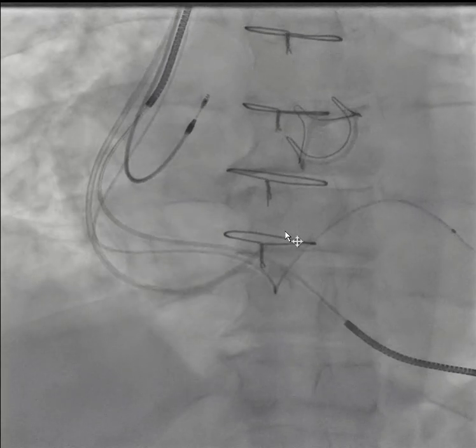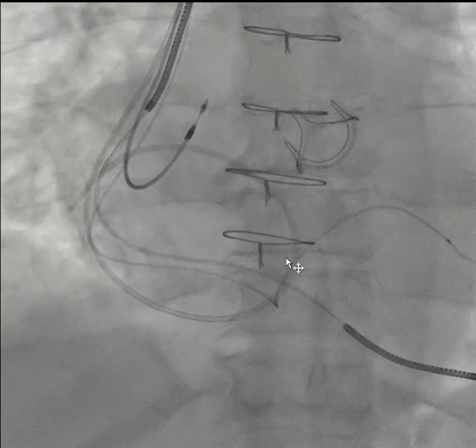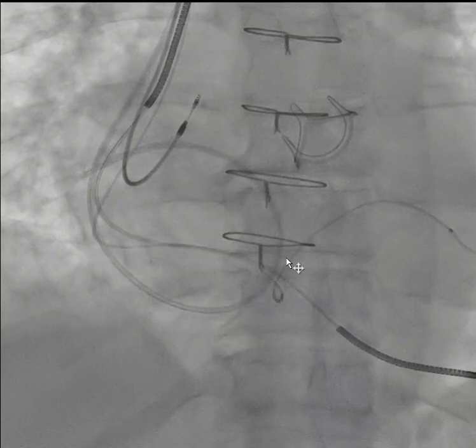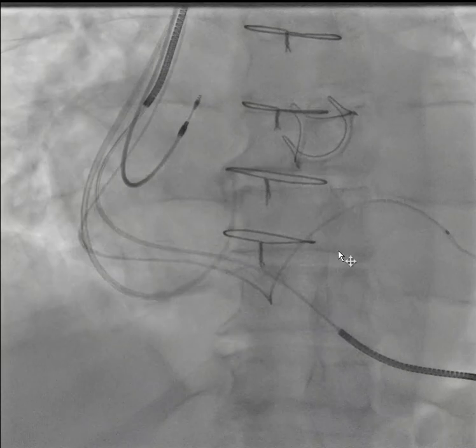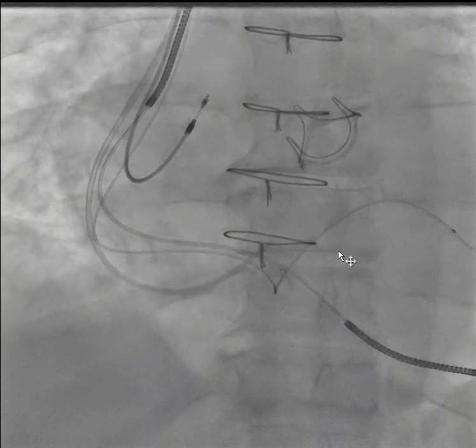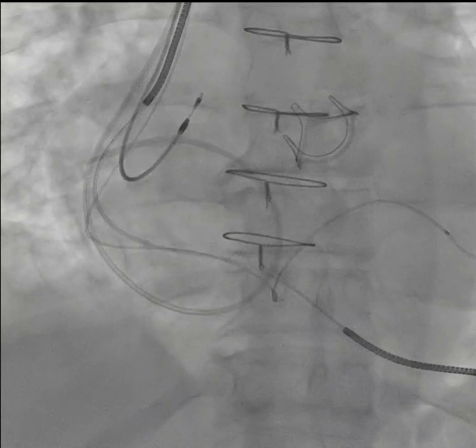Once it's in the right ventricle, you can slightly advance it, then put the balloon up and advance it further.